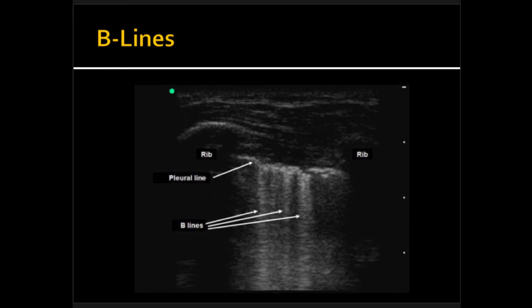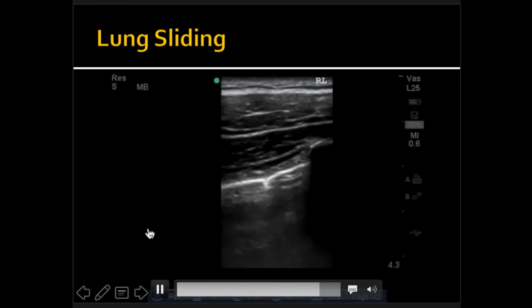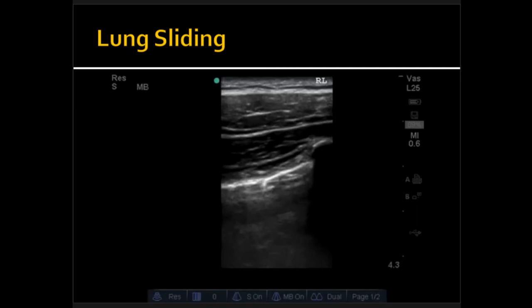If you like motion — lung sliding. For those who haven't seen it, lung sliding indicates movement of pleural surfaces against each other during respiration. This rules out pneumothorax at the side of the probe, but it does not rule out pneumothorax completely. Sometimes people just do one view on one part of the chest and then move on to the other side without going down rib by rib.